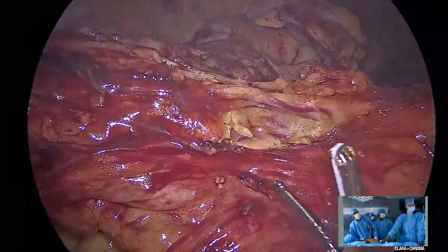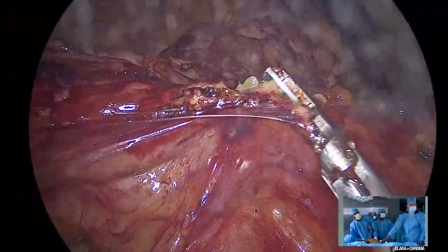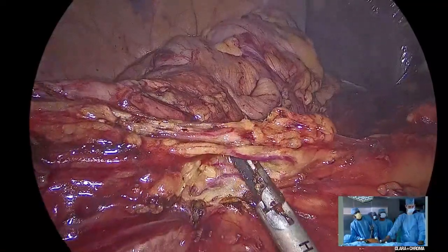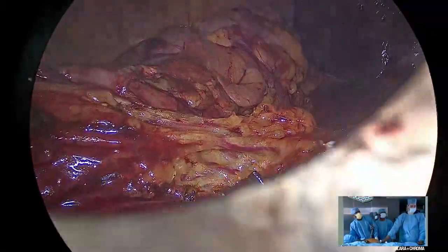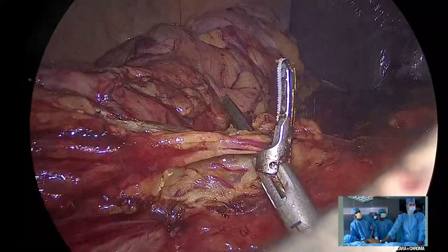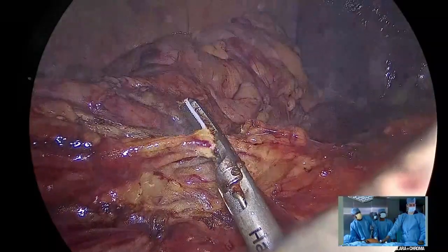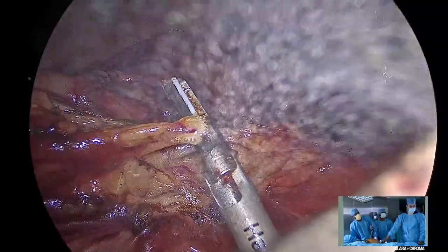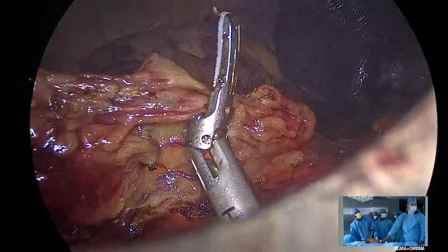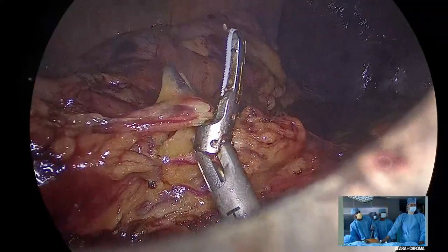At what point are you planning to take the middle colic? Meaning at what point? Not now. My idea is to get the gastrocolic omentum freed up a bit, and then shift my monitor to the patient's head end, and me going to the patient's foot, since I've got the patient in the lithotomy position, and then lift the transverse colon up and go to the origin of the middle colic. That's the plan anyway. You take the middle colic from below or from above the colon? Sorry, below, sir, below.